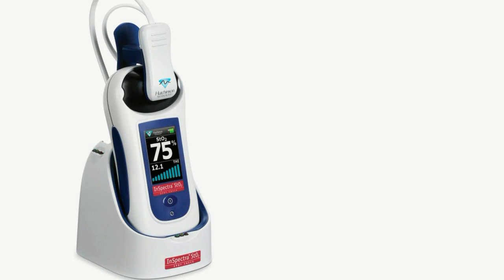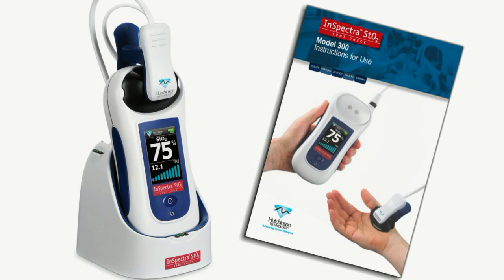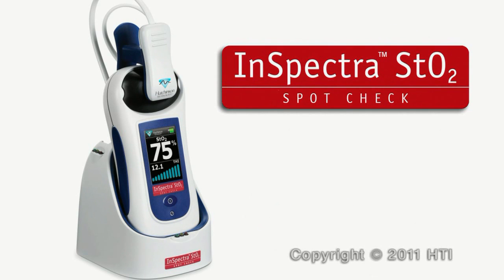This module introduced you to the basic operation of the InSpectra STO2 SpotCheck. Please review the user manual to fully understand the device, its operation, and the potential risks to user and patient before using InSpectra STO2 SpotCheck.